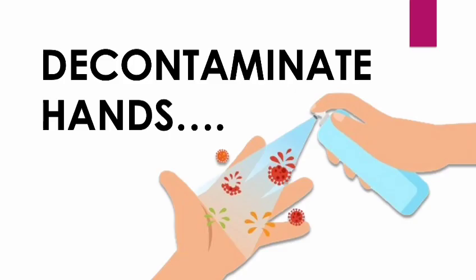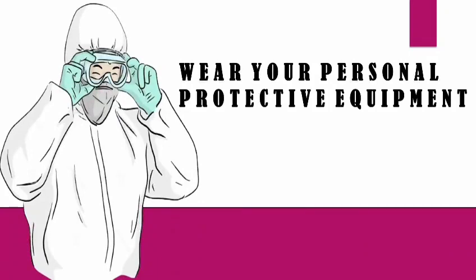To prevent cross-infection and contamination, decontaminate your hands. Wear your personal protective equipment. In this instance, you will be wearing your gloves and your apron as per hospital protocol. This is done to prevent cross-contamination.